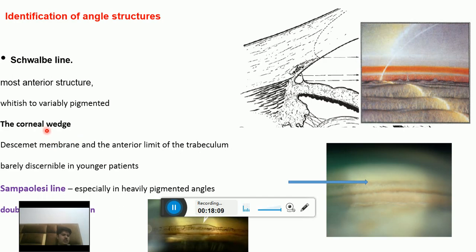Next is the corneal wedge. It is useful in locating an inconspicuous Schwalbe line. Using a narrow slit beam, two distinct linear corneal reflections can be identified. Here you can see one on the inner and one on the outer corneal surface. The outer reflection will arc across the corneoscleral interface, due to the sclera being opaque, to meet the inner reflection at the apex of the corneal wedge.